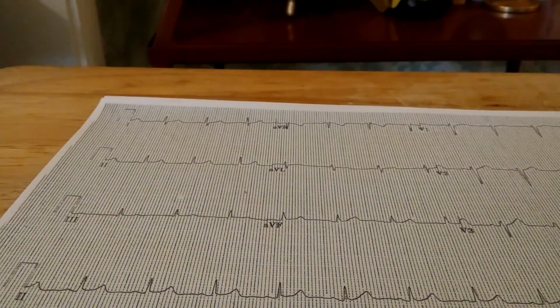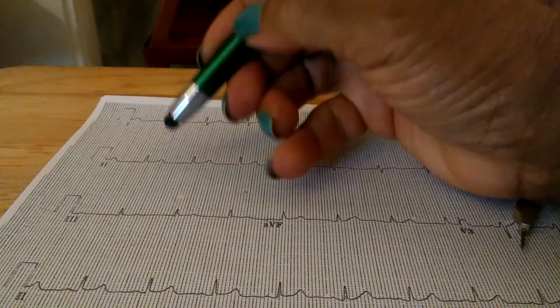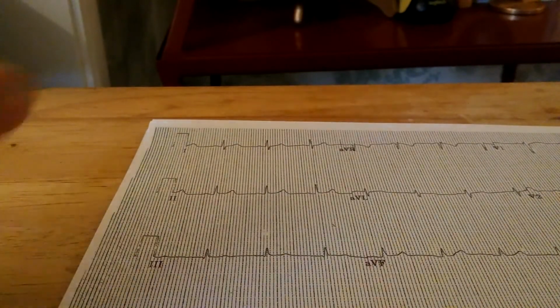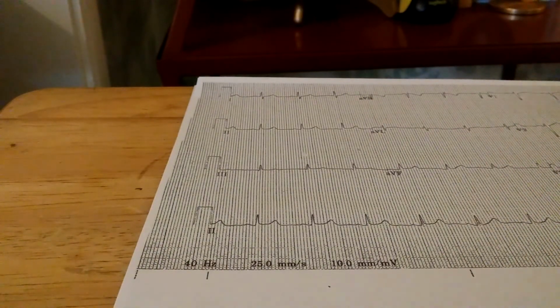We know that normal means we'll find a good P. A good P would be down here. You can see that.